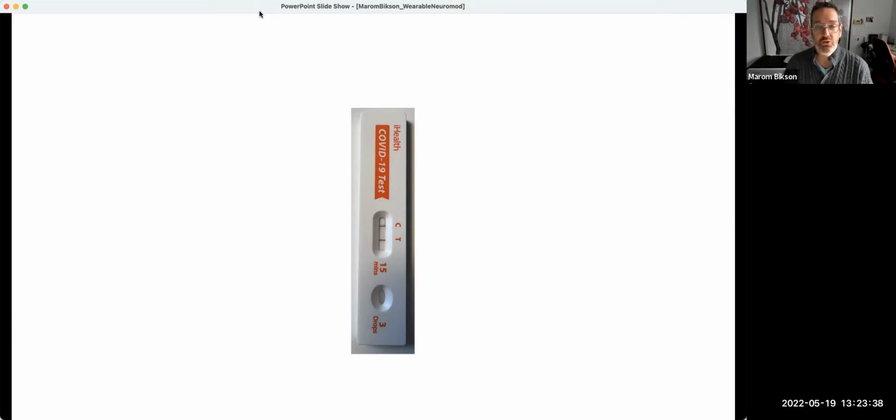While I think that's still true, I've also come to realize that there's a tremendous opportunity here. I'll give one example. There's a group in Brazil, in Paraíba, and they started to run trials for long COVID using a form of tDCS called high definition tDCS. They were including patients who were reporting respiratory distress, trouble breathing, getting tired. When they first started to run the trial, they were doing physical assessments of breathing capacity, whether it's breathing volume or breathing velocity.